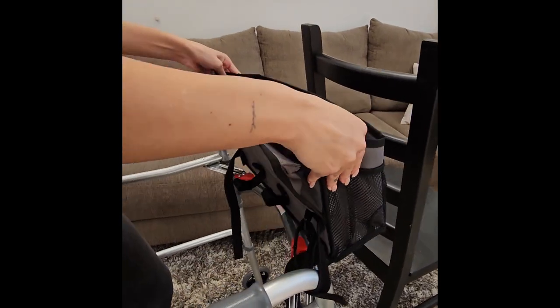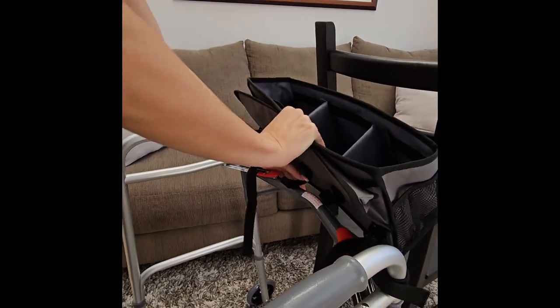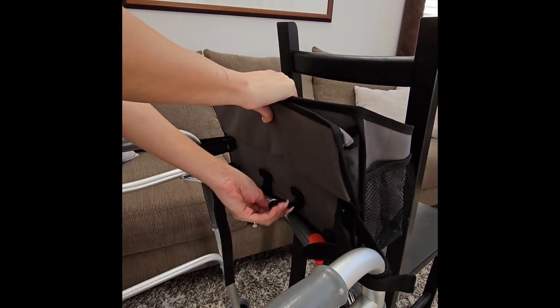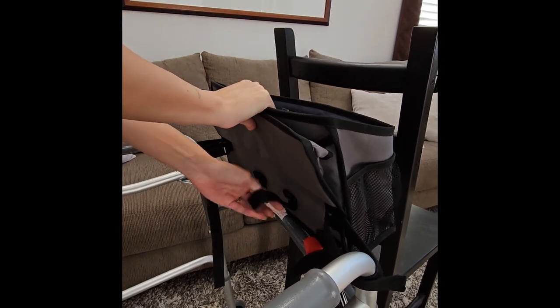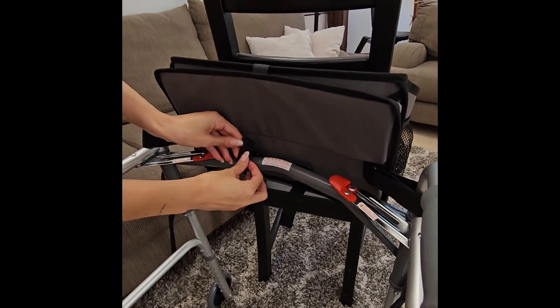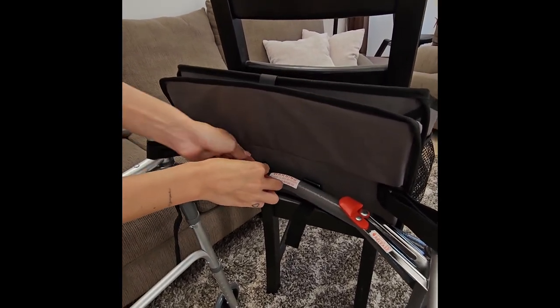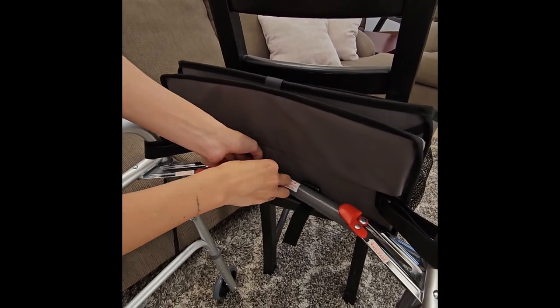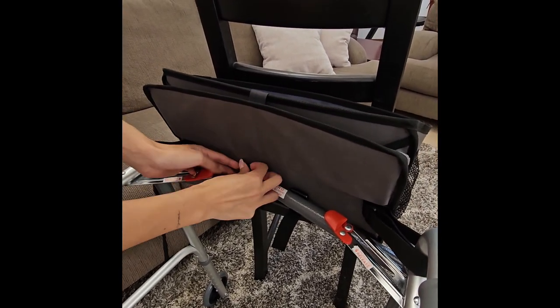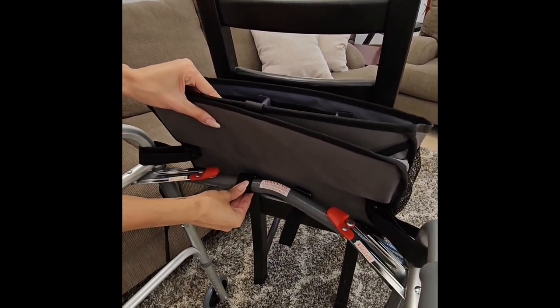You will no longer need the chair or wall for support. Now you are ready to attach the two short center straps. Bring the straps from underneath the crossbar and through the buckles, and secure them with the velcro.